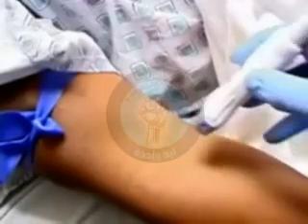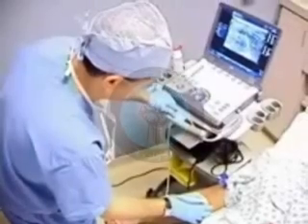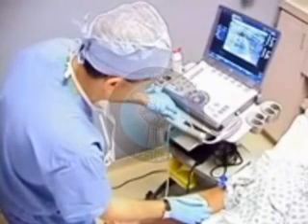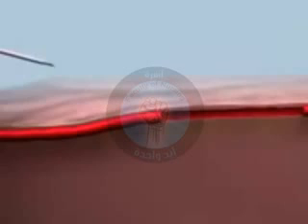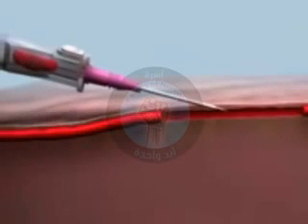Transillumination or ultrasound may also be used to help locate a vein. These have been shown to improve the success rate of the procedure and to reduce the amount of time needed to perform it. Blood might flash back into the chamber if the tip of the needle has entered the lumen, but the cannula has not yet entered the vessel lumen itself.